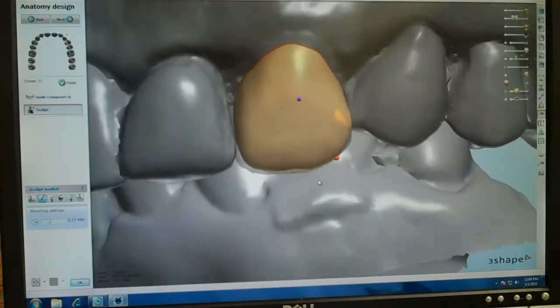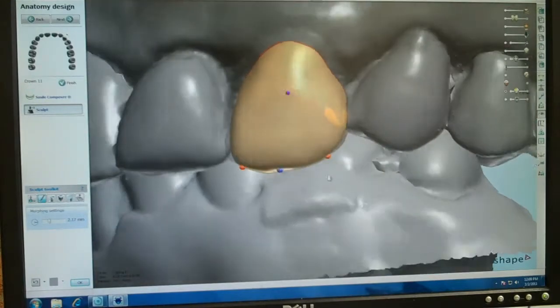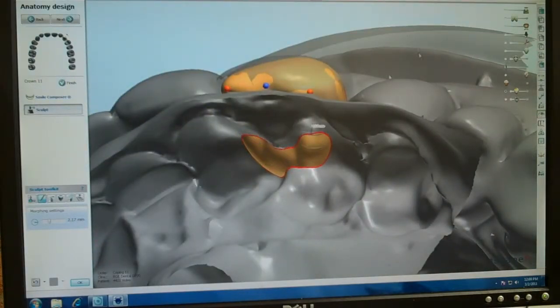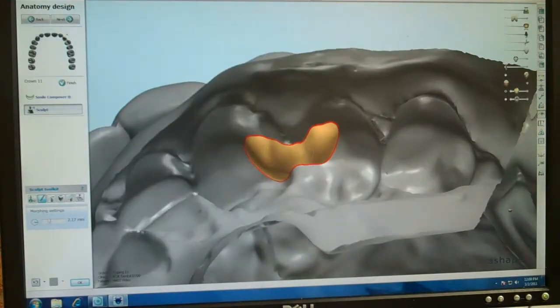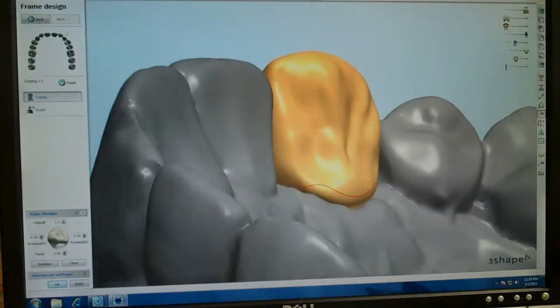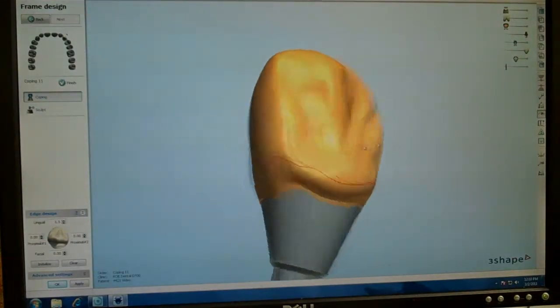We're now on the coping. In this scenario we don't have to match our study model exactly because we're going to cut this back — we want to get pretty close because this is our core, our substructure. This shows that we're actually high in occlusion, but with just the click of a button we can fix that. The lingual band is actually anatomically correct.